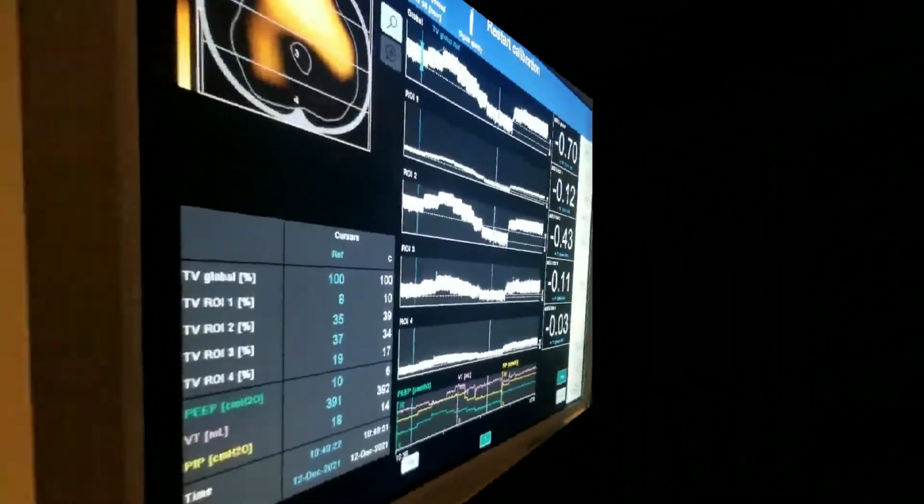All right, thanks. Okay, so we started when we had a PEEP of 10 at 60% FiO2. And since increasing the PEEP to 12 based on the optimal PEEP study on the PulmoVista, we're down to 50%, and that's almost within half an hour of the adjustment. And we're satting 95, so hopefully that sat might go to 96, 97. I can wean down to 45. So it'll be interesting to see over time, maybe in the coming hours, if we have time to do the follow-up video on the oxygenation for the patient.